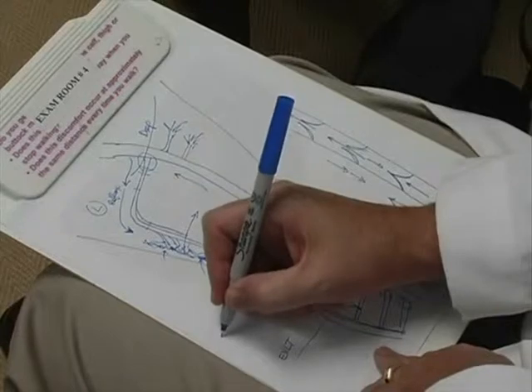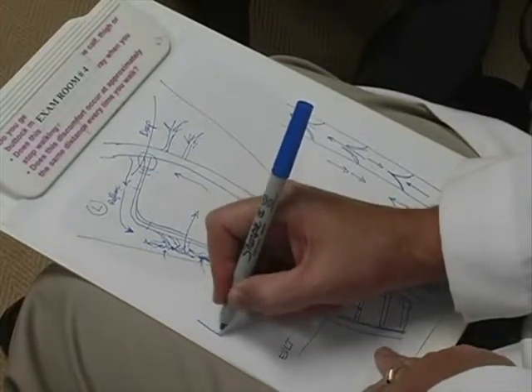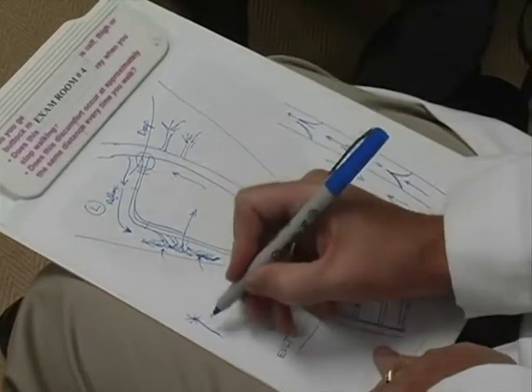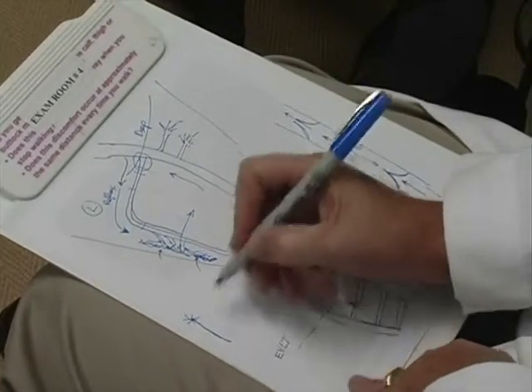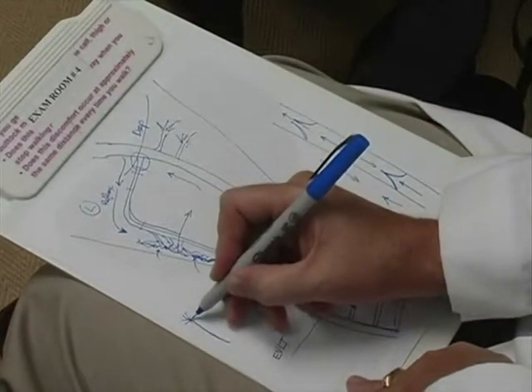Most people have seen the Christmas ornaments that have fiber optics. They have the long fibers and the light comes out at the very tip. We use these same type of fibers, but instead of light energy, laser energy is coming out the tip.